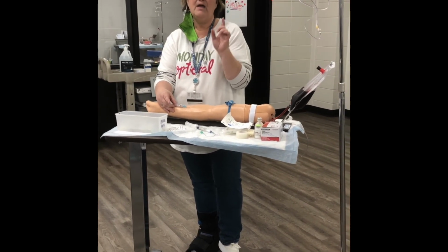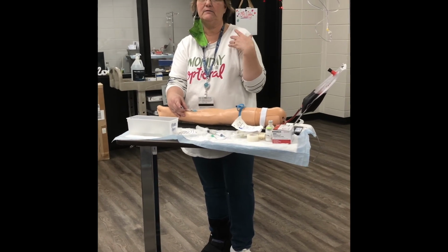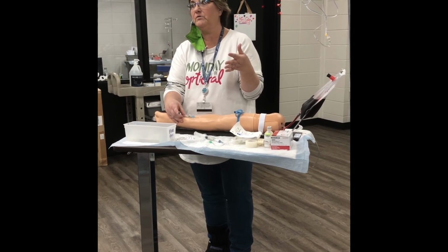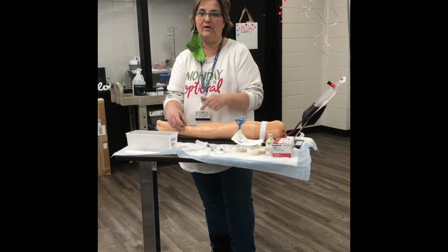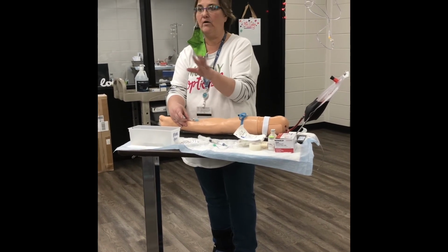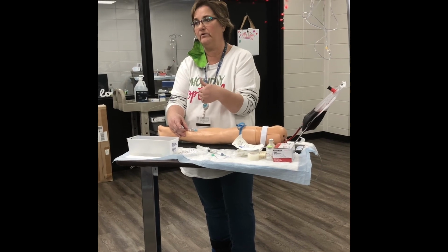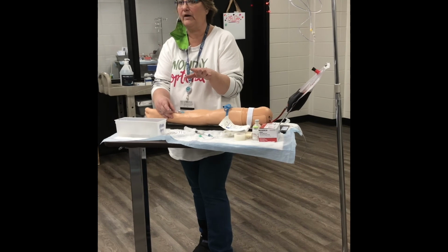However, when you're practicing, these arms, they use them to practice piggyback push. Y'all use them to practice starting IVs and hooking fluids up. So all of this is clear, and you can't see it. I have a little bubble of clear, but y'all are not going to be able to see it. So if you don't get blood return, don't get all upset in here. We'll figure it out, okay?